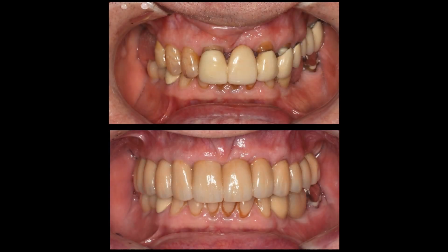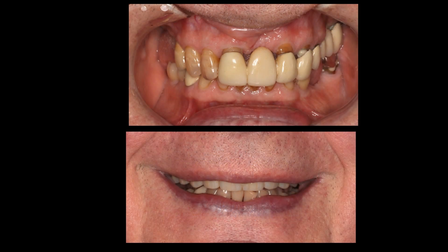And for those of you who have heard so many of my other videos, if the office you're going to cannot provide you with lips retracted before and after pictures, especially the after pictures, then you need to run as fast as you can from that office because they're hiding something. And you'll note on all of my pictures, we have nothing to hide. We show lips retracted on every case. And here is the before and after smile. We didn't actually capture the before smile, but we'll remind you what his teeth looked like before.